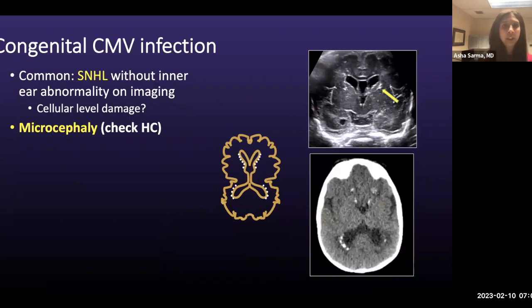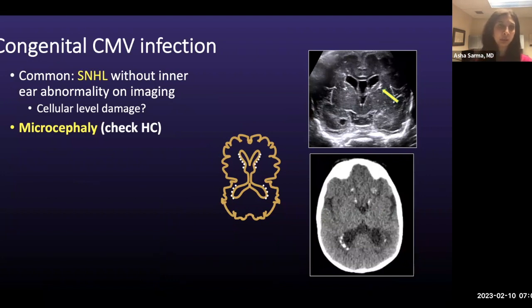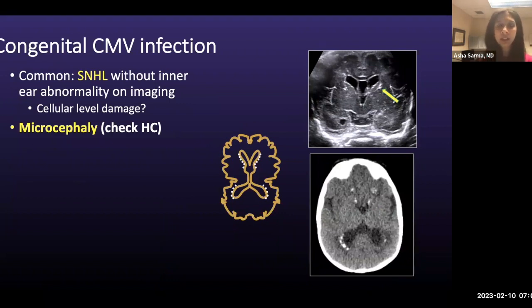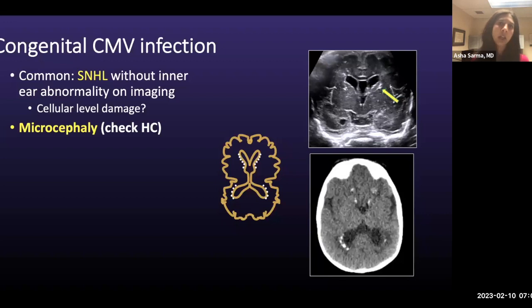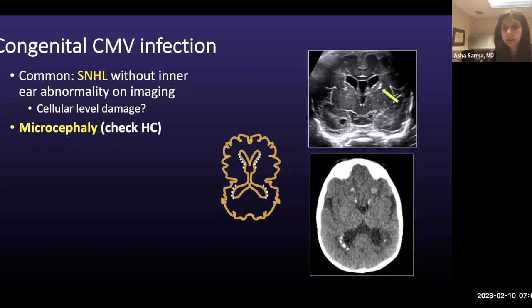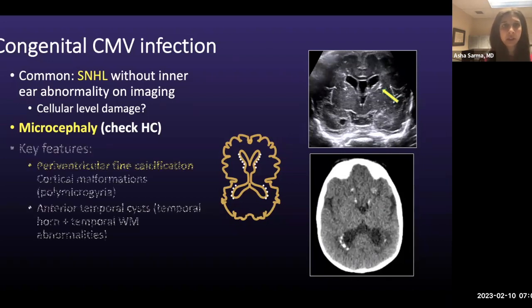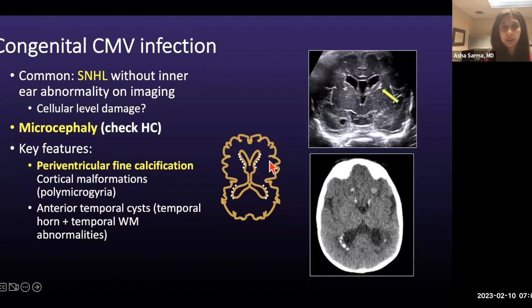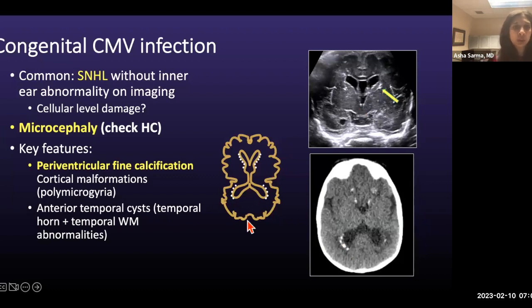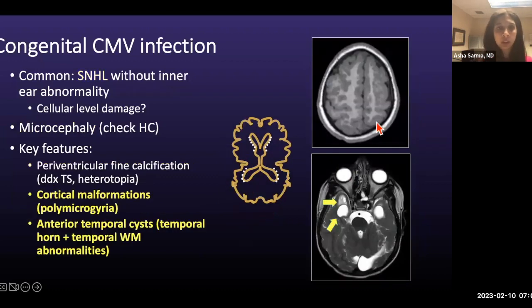Congenital CMV is commonly diagnosed when a patient is referred for sensory neural hearing loss. You might not see inner ear abnormalities on imaging because the hearing loss occurs at the cellular level. I look at the patient's growth chart for microcephaly, which is a really common and important manifestation. Then I look for periventricular calcifications — finer calcifications seen on this schematic, CT image, and ultrasound — and then cortical malformations such as polymicrogyria, with increased gyral frequency and abnormal sulcation.